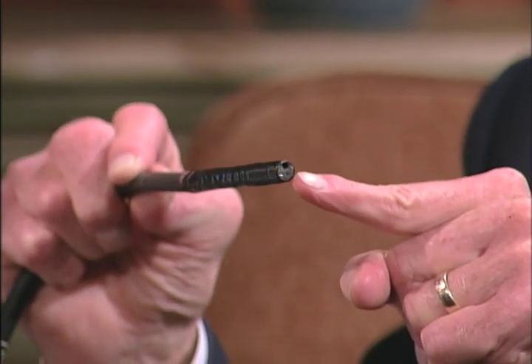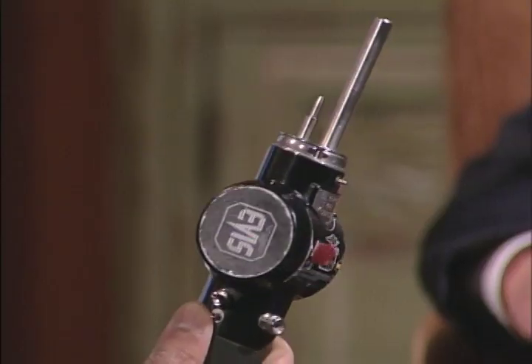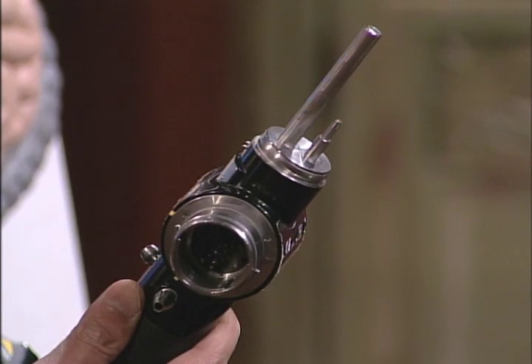So the camera and the light are right here? That's correct. And what do you have in your right hand? This is sort of the lifeblood of the scope. This is what attaches to the computer and the processor so that we can supply light to the end of the scope, see the inside, retrieve the picture information from the inside, and send it back to the computer. I'd call that sort of the power source.